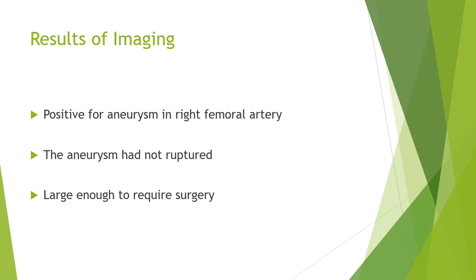The results were quickly read by an on-site radiologist. The radiologist determined that the patient did have an aneurysm in their right femoral artery. The aneurysm was reported to be large, but it had not ruptured yet. The aneurysm was also large enough that surgery would be needed to treat it.